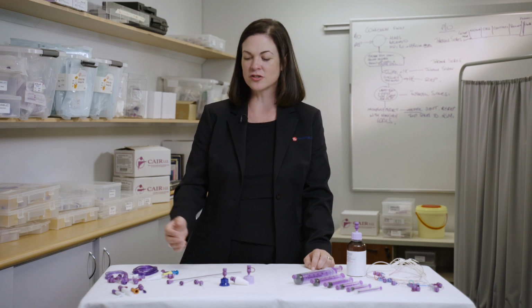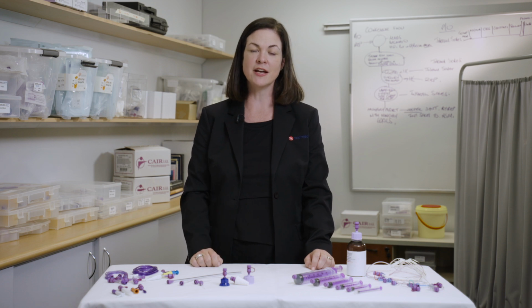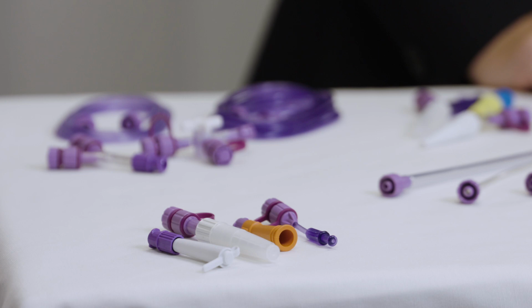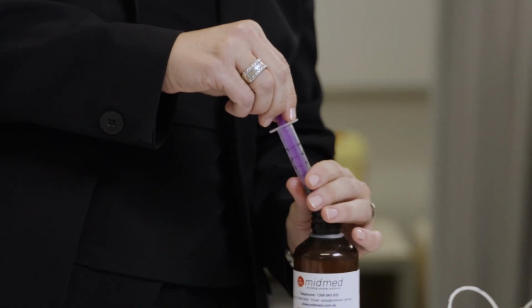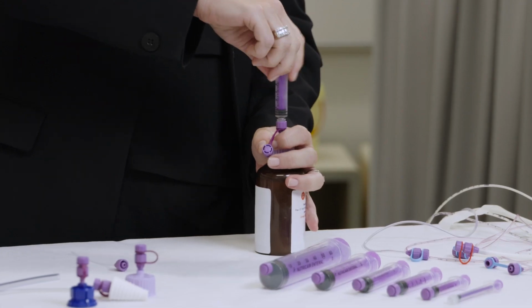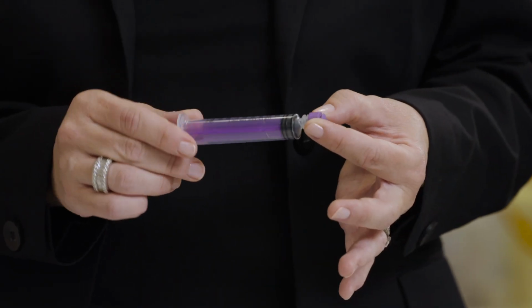Because Enfit is not one specific manufacturer, there are transitional adapters available to ensure that until all enteral feeding lines are Enfit compatible, Enfit can be used with non-compatible tubes. The key points to take from this training is that you must use the drawing up devices when drawing liquids into an Enfit syringe. This ensures accuracy of the dose. It is best practice to cap your Enfit syringes once filled.